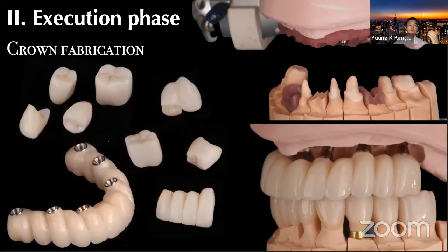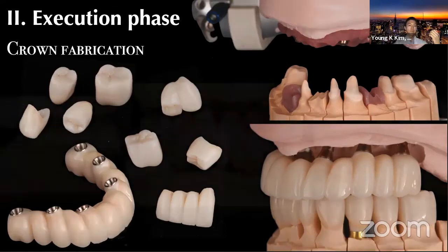So for a full mouth, full arch implant rehabilitation, I personally prefer a monolithic zirconia with a facial cutback if necessary. And these days we have superior characterization techniques on the monolithic zirconia as well.